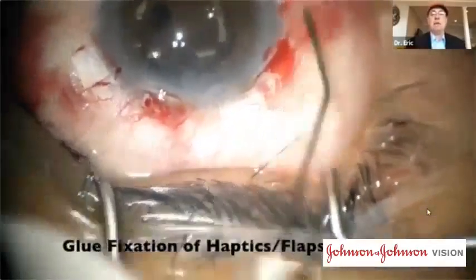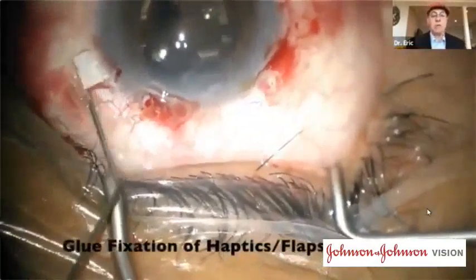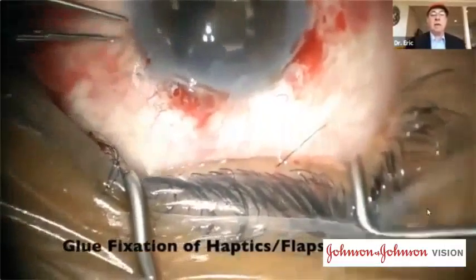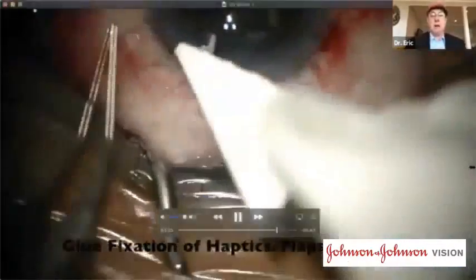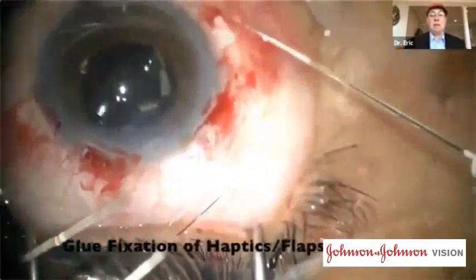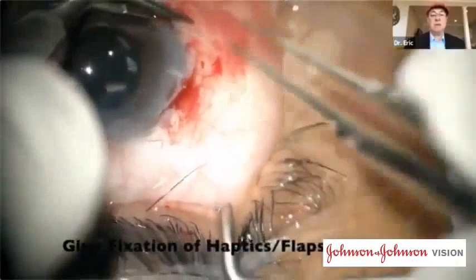apply glue, tissue glue here, and it's called the glued IOL, but the glue is probably the least important part of the procedure. And then once the glue is applied under the flap, I smooth down the conjunctiva, and this basically completes the entire procedure. The procedure can be done in just 15 minutes or so.